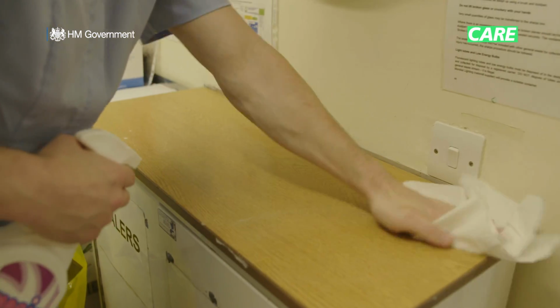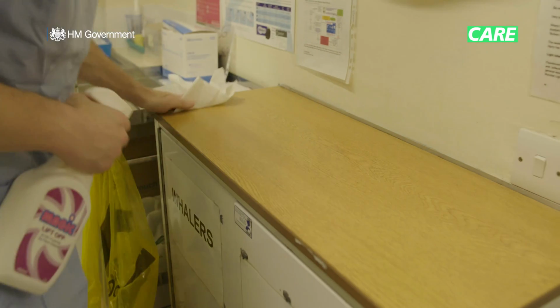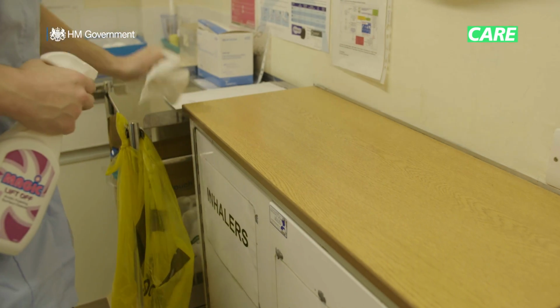If you're testing more than one resident, it's crucial that you wear a different apron and gloves for each and every resident you test, disposing of the personal protection equipment safely in between. You can refer to latest Public Health England guidelines on sessional masking. In the space where you're performing the test, you'll need a clean and dry surface. This is where you'll unpack and set down your kit.